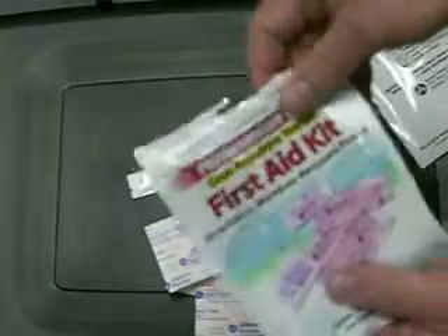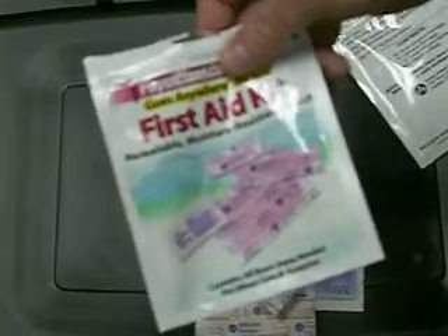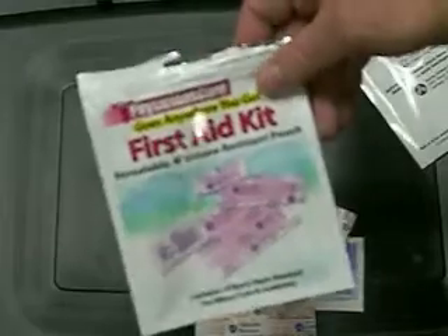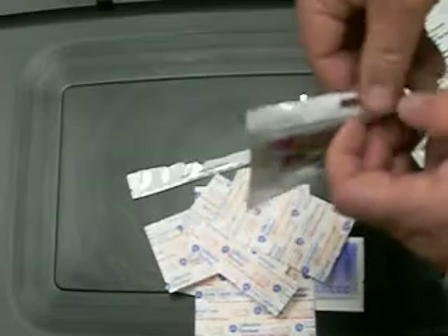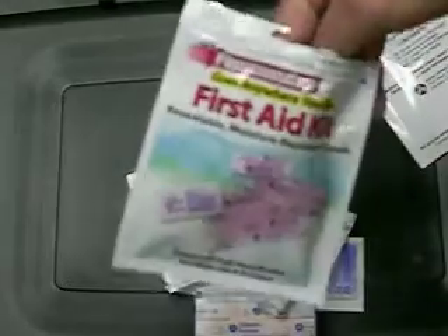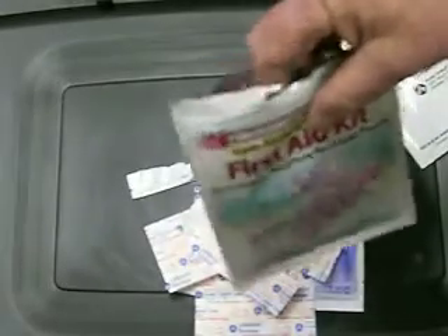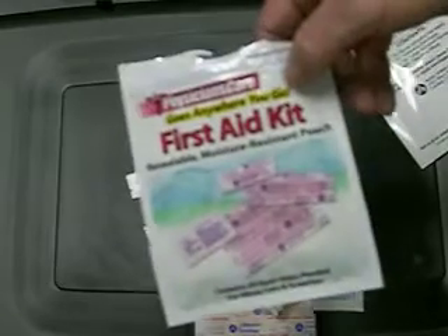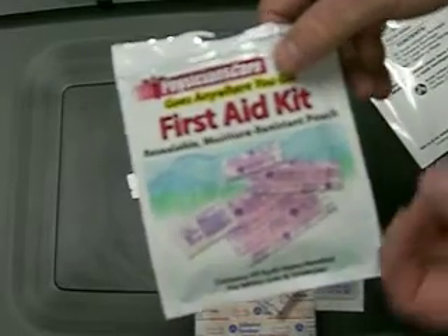It's a water-resistant package. We're going to be using these all over the place — for duck hunting adventures and out on the range. Really can't think of any place we would not want to have one of these. Sure, there are big advanced first aid kits where you can do minor surgery, but 99% of our little cuts and bruises, this is going to handle.